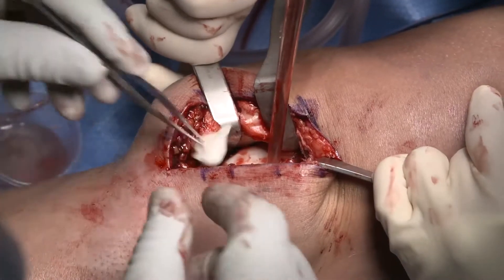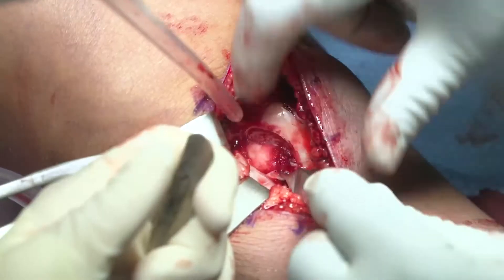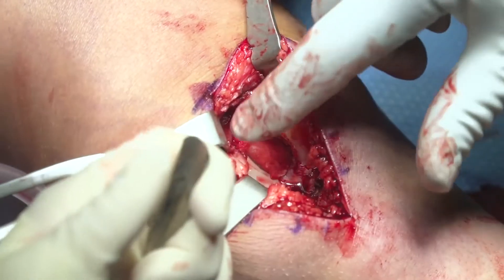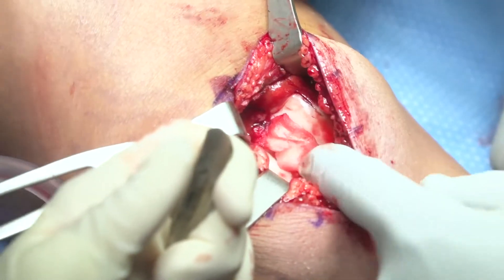We used a thrombin-soaked gel foam patty with some direct pressure, and a little bit of residual bleeding was managed using just a bit of fibrin glue with pressure in the defect, and that controlled nearly one hundred percent.